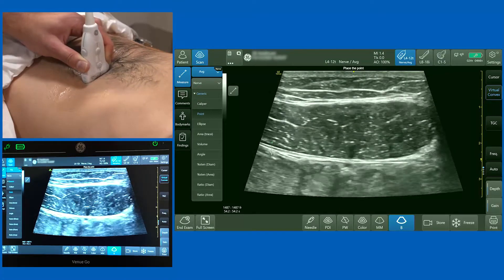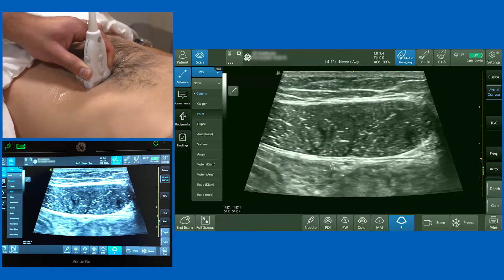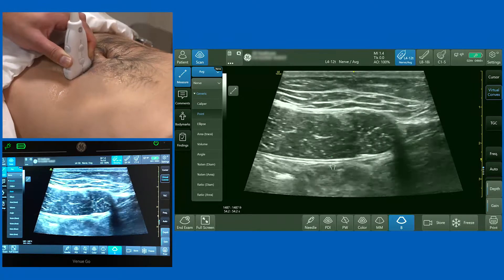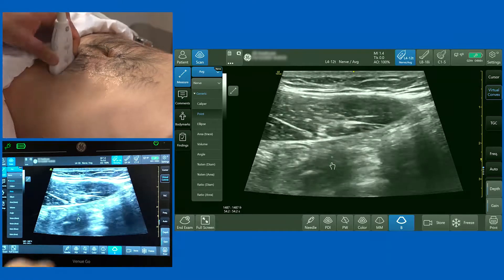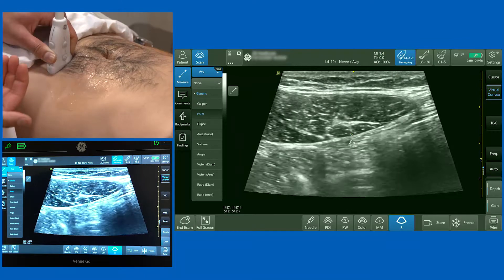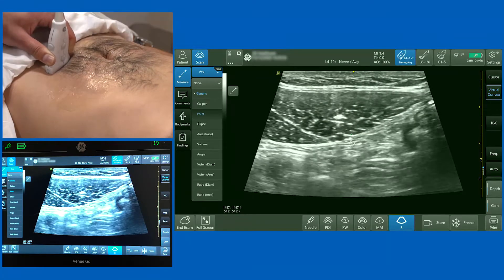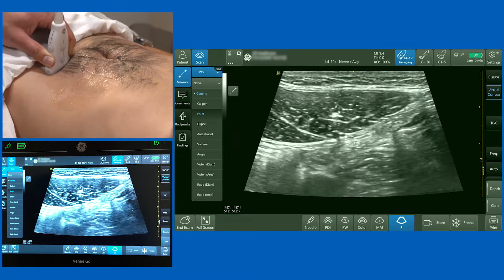Now why did I highlight the tram-line appearance of the posterior rectus sheath, transversalis fascia, and peritoneum? Because as you slide the probe down the abdominal wall, there will be a point where there is no posterior rectus sheath. Below what's called the arcuate line, all of the fascia of the abdominal muscles passes anterior to the rectus abdominis, so there's no posterior rectus sheath. If you deposit local anaesthetic at the posterior aspect of the muscle here, you risk putting your needle into the peritoneum.